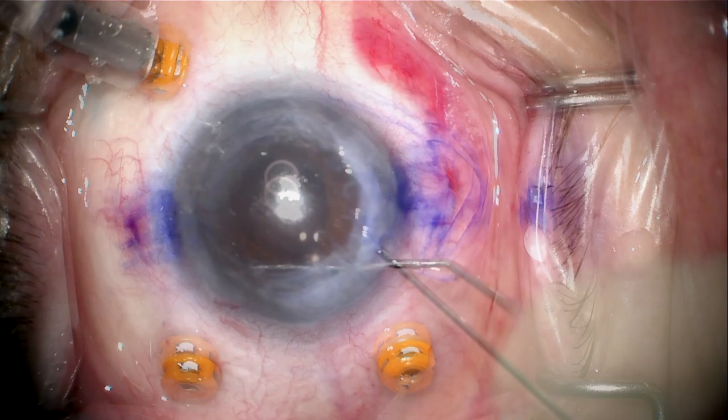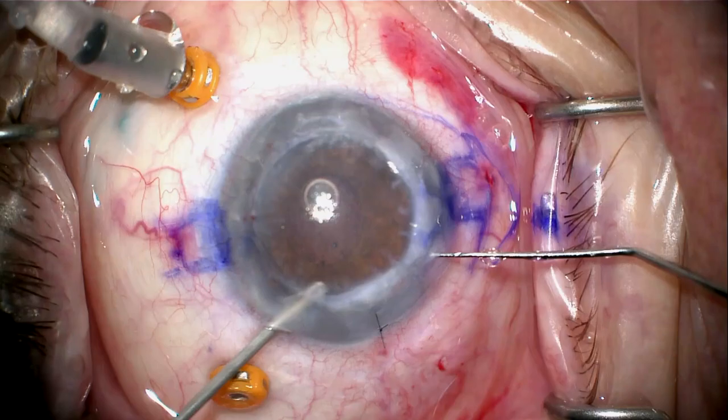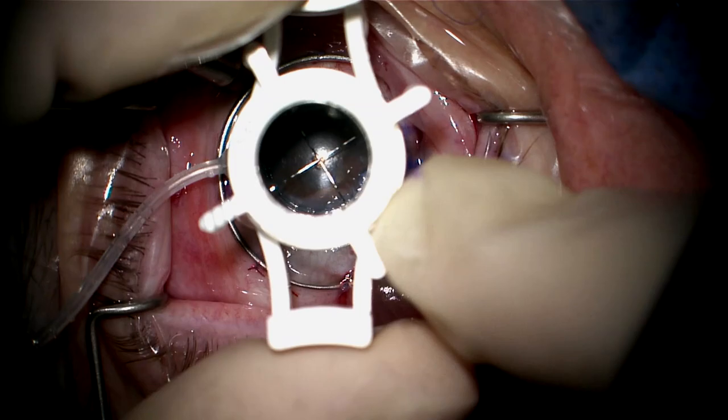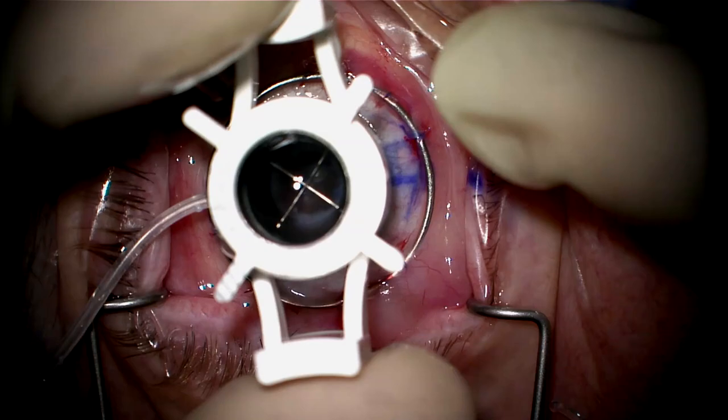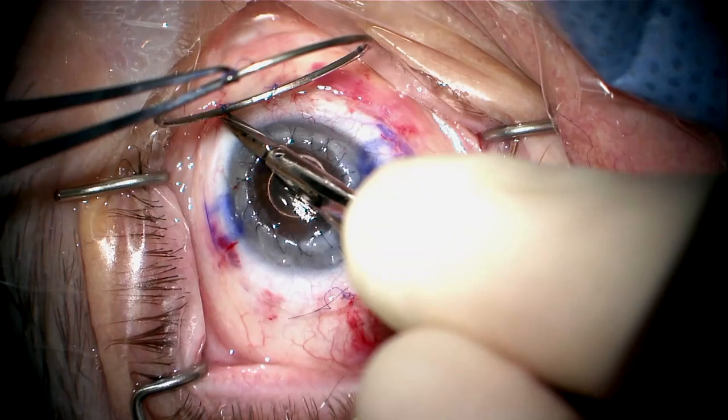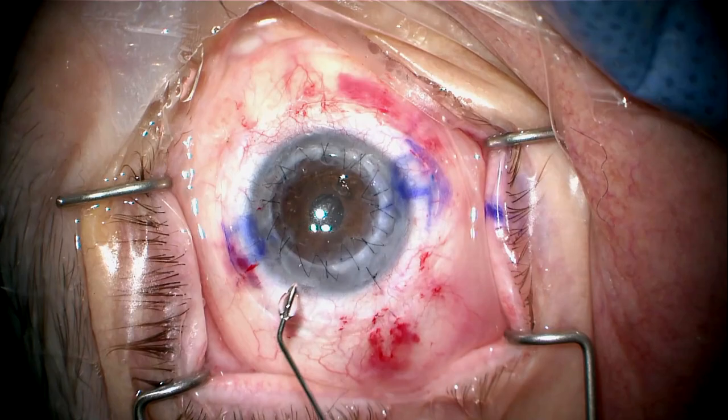I'll put in some miotic to bring the pupil down and stroke the pupil so I can make a peripheral iridotomy with the vitrector at 6 o'clock. Now I'm going to remove a couple of the trocars and suture my Flieringa ring in place. I've left my infusion line trocar with the infusion off. Here we're doing our trepanation with a Barron-Hessberg vacuum trephine, cutting out the diseased cornea, and suturing the new graft in place with 8 interrupted sutures and a 16-bite running suture.